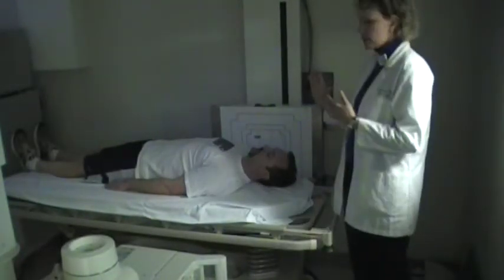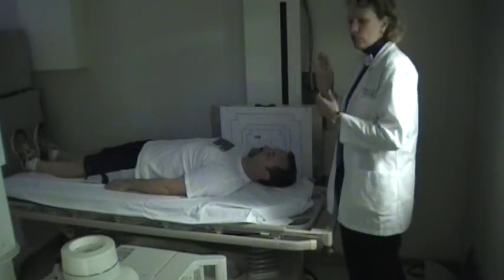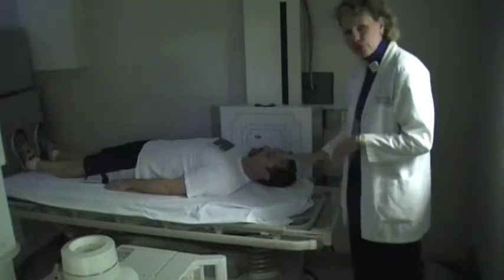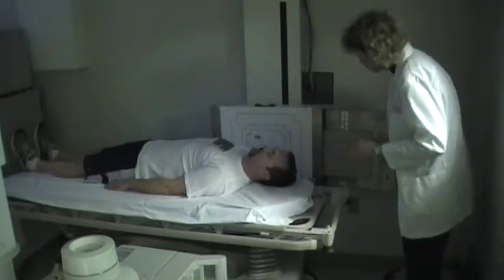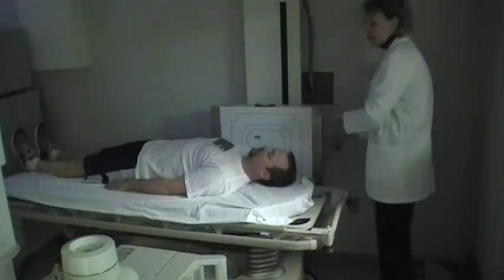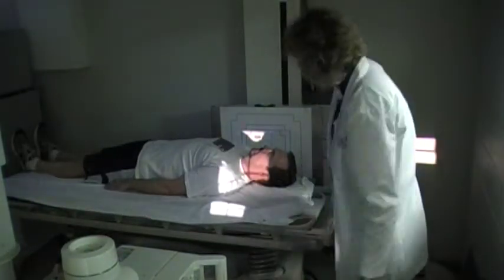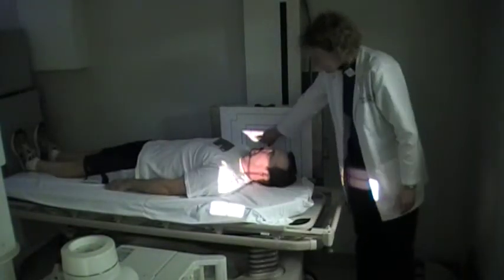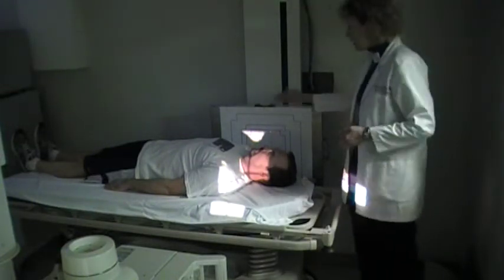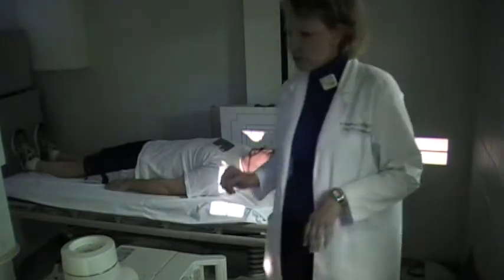When your patient is standing up, you have your image receptor loaded as portrait, but when they're lying down in the dorsal position, you're going to want it going crosswise. Go ahead and push your image receptor in. I've got my left marker here — change this to right, because it's the patient's right shoulder that is touching up against the image receptor.